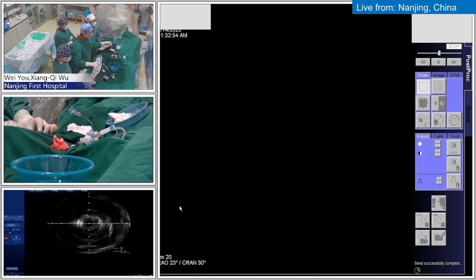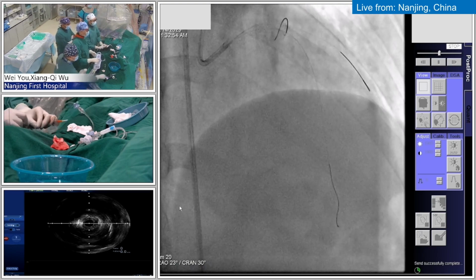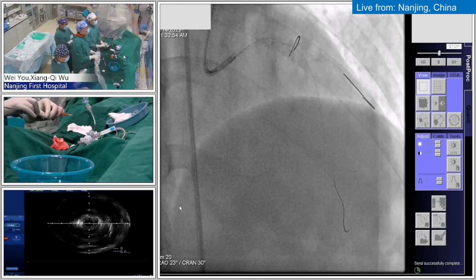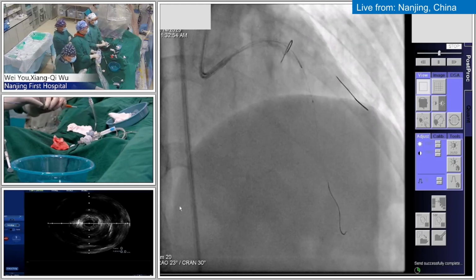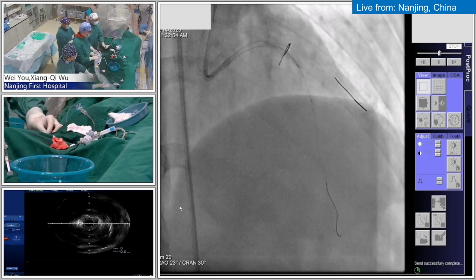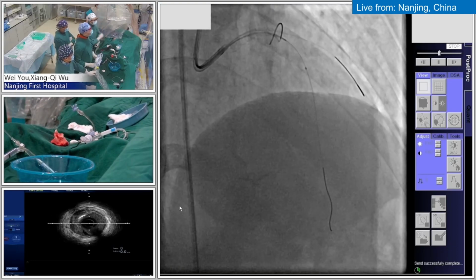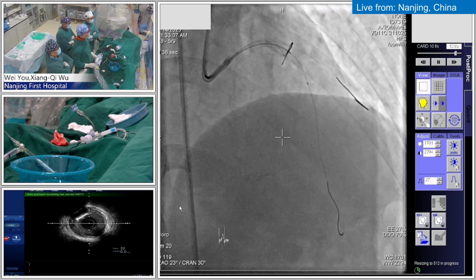Questions coming up: within the IVUS space, are there some emerging patterns of use? My question to you is, are the Chinese companies making imaging equipment, and how good are they?